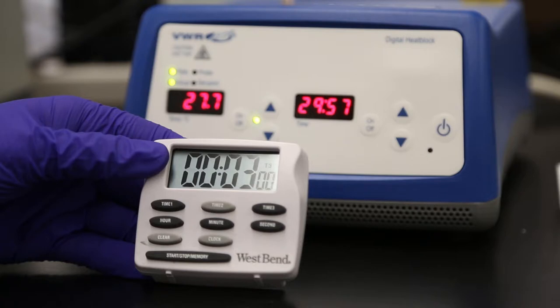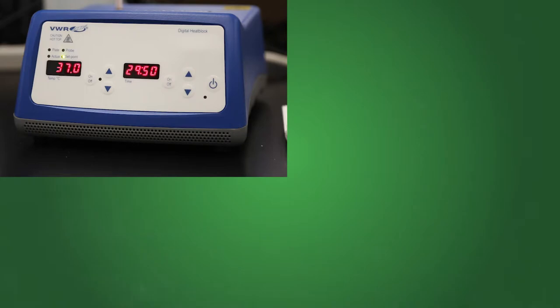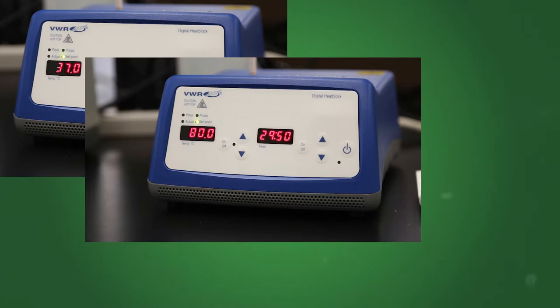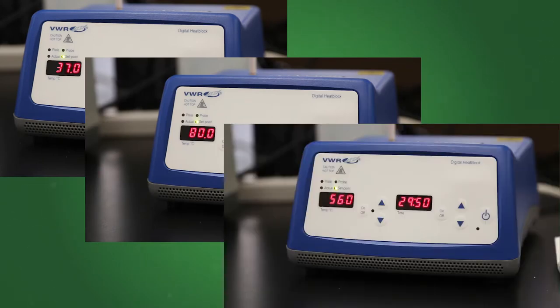Instead, use a timer similar to this one, set to 3 minutes. If you are using three single blocks, set the first to 37 degrees Celsius, the second to 80 degrees Celsius, and the last to 56 degrees Celsius. Remember, the green light must be on for the block to heat.